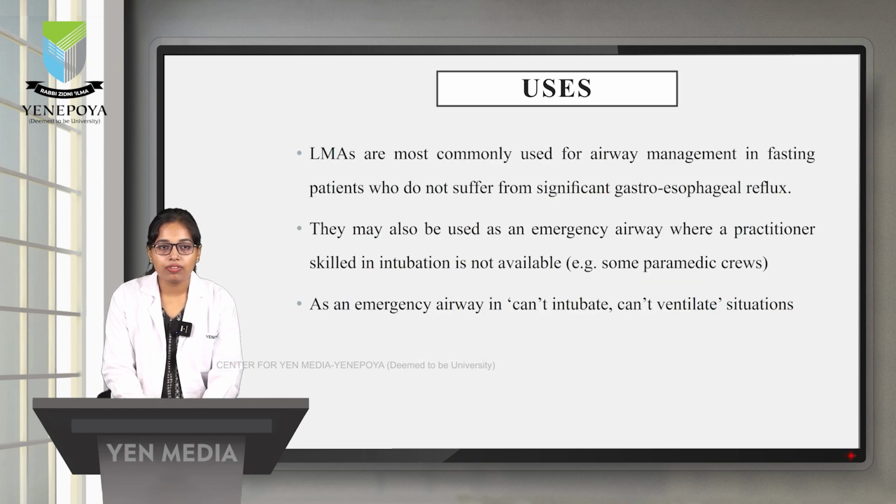The uses of laryngeal mask airway are for airway management in fasting patients who do not suffer from significant gastroesophageal reflux. They may also be used in an emergency airway where a practitioner's skill in intubation is not available, or in situations where the anesthesiologist cannot intubate or cannot ventilate.